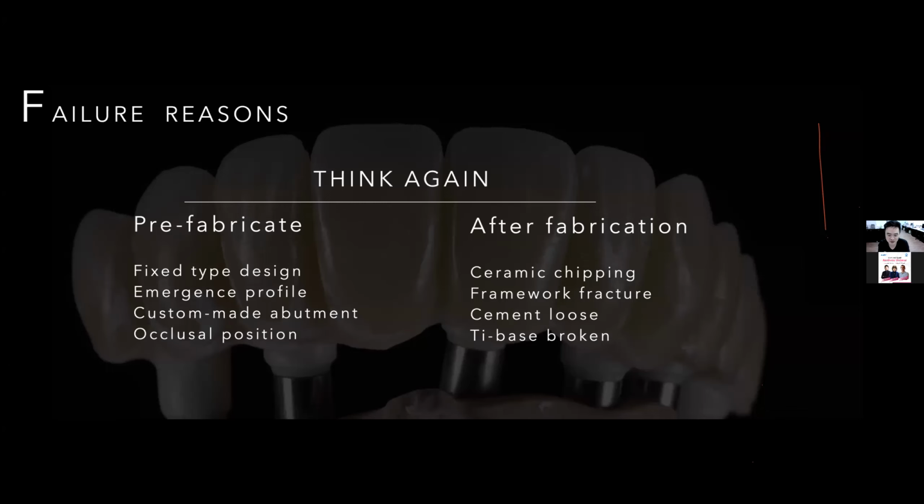So please take care. In my opinion, the ti-base is a very, very important thing for us. Never let it cause a problem for your customer and the patient, because this is a big problem and you will lose their trust.